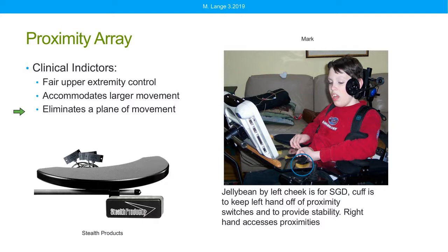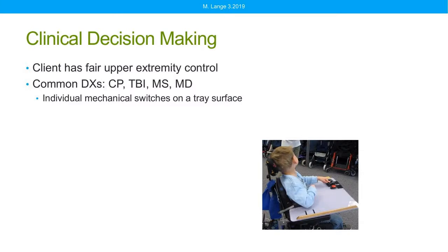Corey has asked, why is there no back or reverse button on that young man I showed a picture of a second ago? I'll go back here. He's just starting to drive. We're doing an evaluation here, and we wanted to get a sense of how he would do with forward, left, and right. And I often do not add a reverse switch right away. I want to see how the child will do, since this is a brand new experience for him, before I add in reverse to the task.